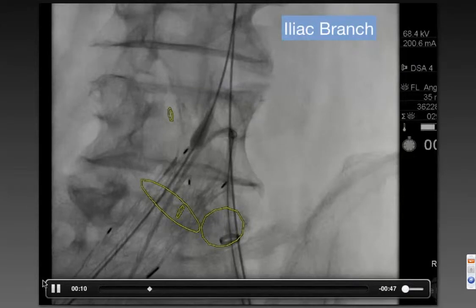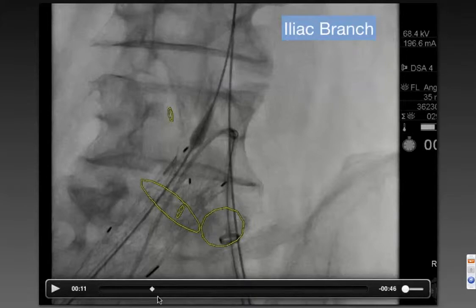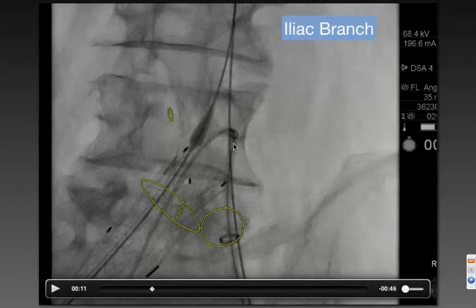Let me just stop that for a minute. Just like diagnostic catheters, you can have issues when you're pushing forward of losing purchase. What you're looking at is the diagnostic heading up against the wall of the endograft and it's backing out the sheath, just exactly the same as you would see when you're doing this manually.